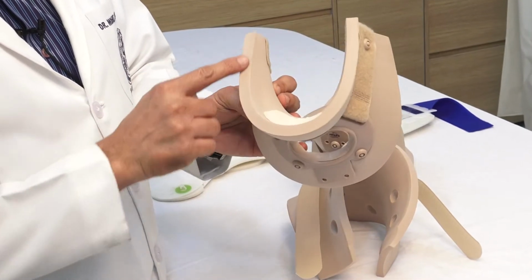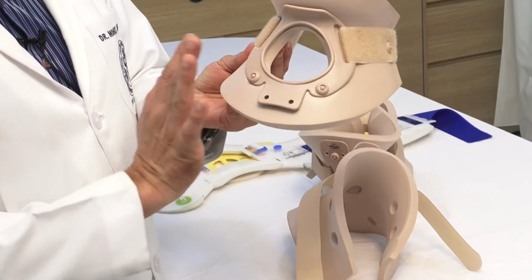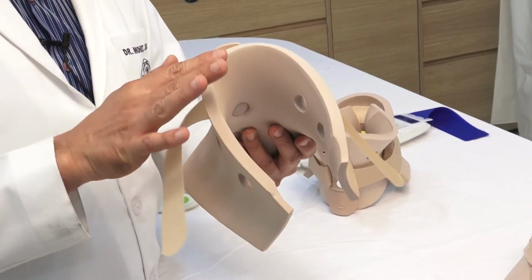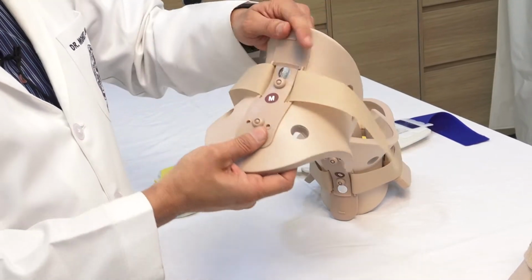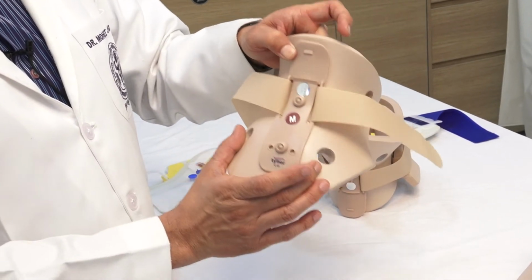The upper part of it is shaped in the form of a mandible, and there is a chin rest over here, and this broader part goes towards the shoulder. Similarly, in the posterior component, the narrow part comes at the occiput of the patient, while the broad one goes on the base. In fact, it is mentioned here: this is the back component and this side is up. It is all mentioned on the collar.